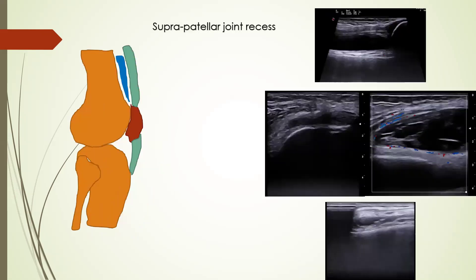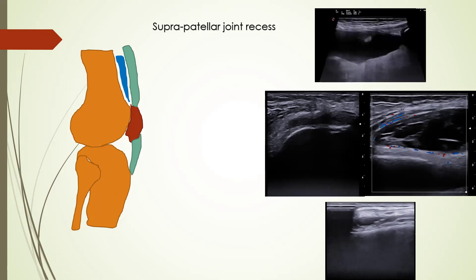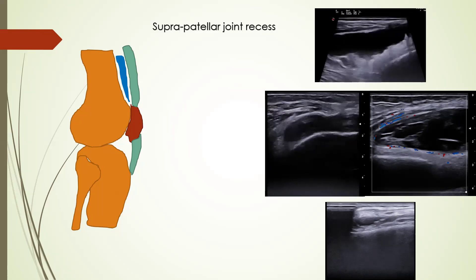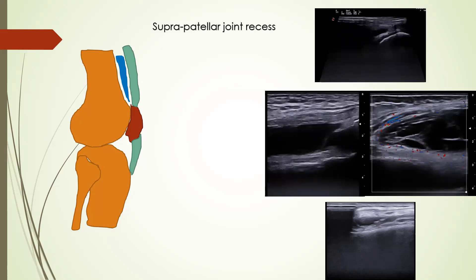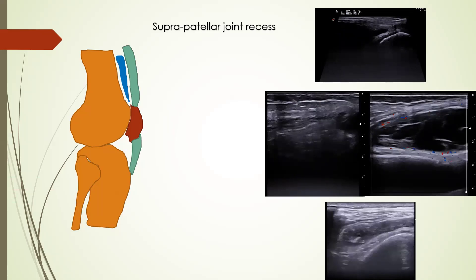Next is the suprapatellar joint recess. When there is joint effusion, it accumulates in the suprapatellar joint recess, and the echogenicity of the joint fluid is affected by the underlying pathology. It can be echo-free, as in this case where fluid is completely echo-free but there is hyperechoic synovial thickening suggestive of chronic synovitis. Fluid can also be complex, with presence of soft tissue, crystals, and loose bodies within the suprapatellar joint recess.